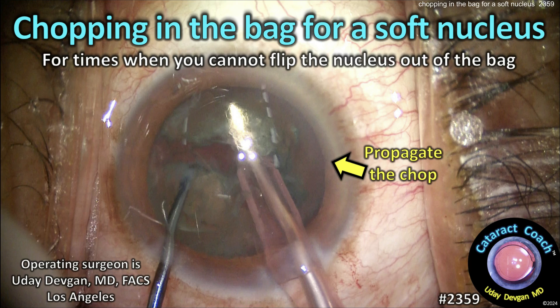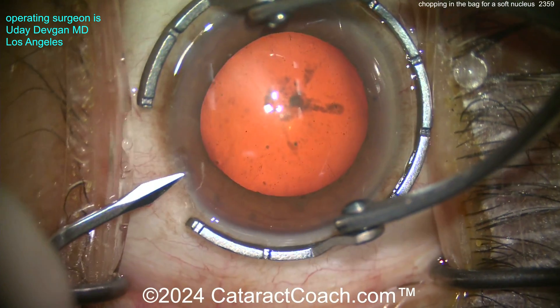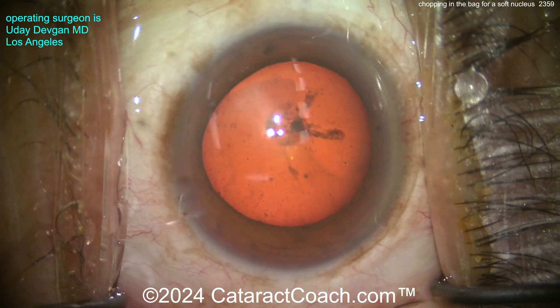CataractCoach.com — chopping in the bag for a soft nucleus. For times you just can't flip the nucleus out of the bag, you can just chop it in the bag. This is a complete cataract case of me operating.